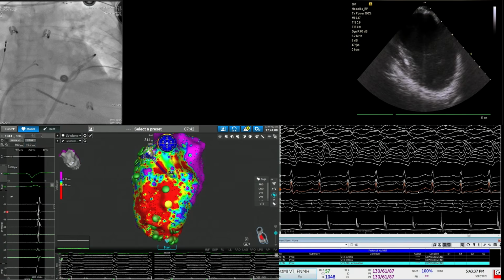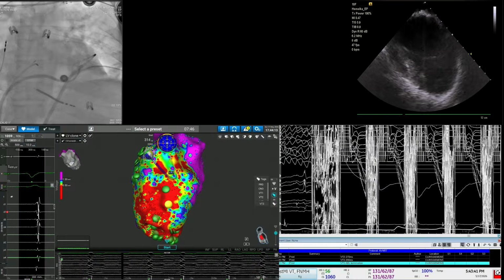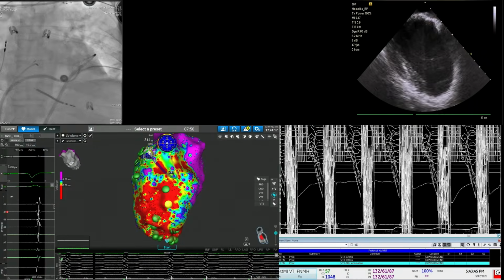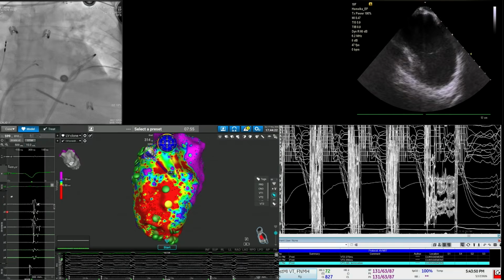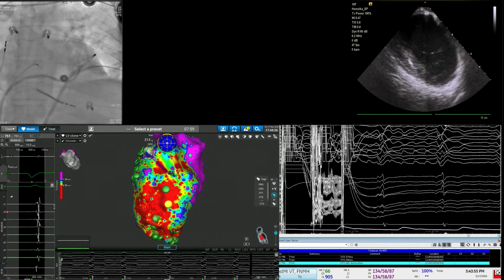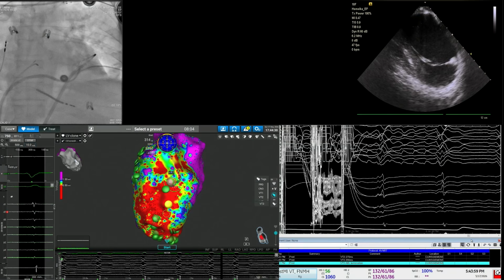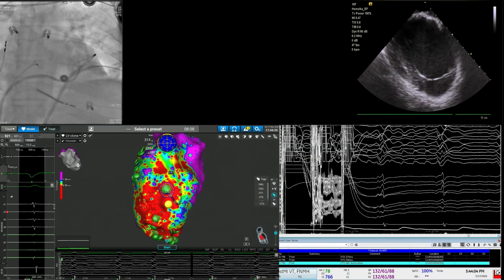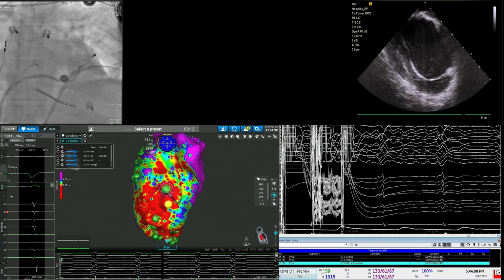Yeah, go ahead and just click on the termination. And then ablation here was able to terminate this VT. So there's the ablation. Let's get past it. Now we have slow Pruka also. Everything's going slowly today. Okay, and then the VT here terminated. So that happened just as you guys were coming back to us. But then I know you went to other places. So after this, we decided to homogenize in this region. Can we show the remaining lesions, please?